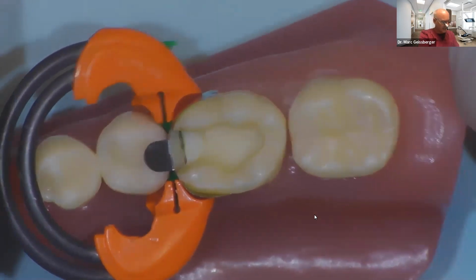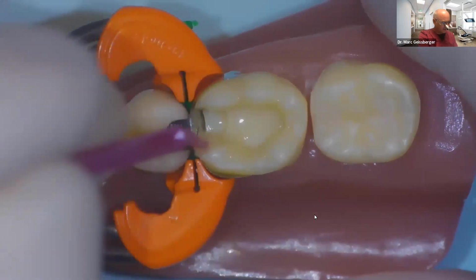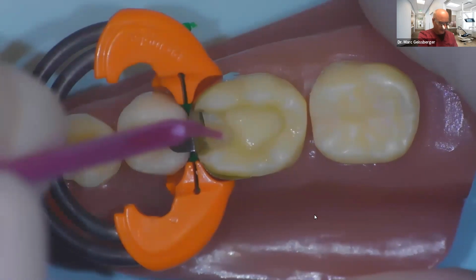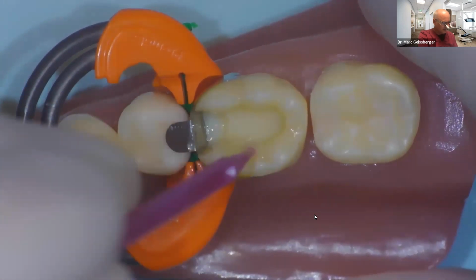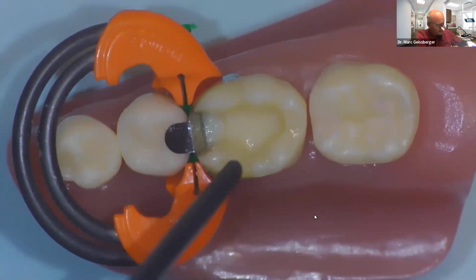I would have total etched the entire surface. Now I'm going to come in here and place my adhesive layer. And I'm going to scrub that. I want this infused. And as I do this, I generally re-dip, okay? So I'll re-dip here and go ahead and reapply. And now I'm going to air thin, and you really want to get this thin down to that 2 microns. How do we do that? We do that with about a 5-second air blast. So what I'm going to do is I'm going to hold this clinically right above.